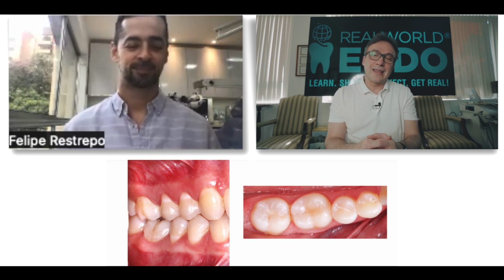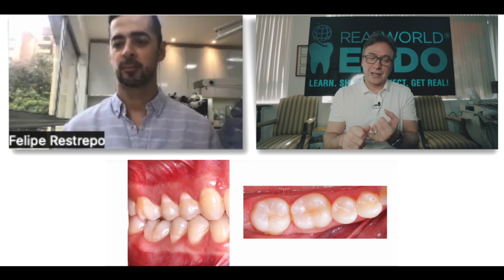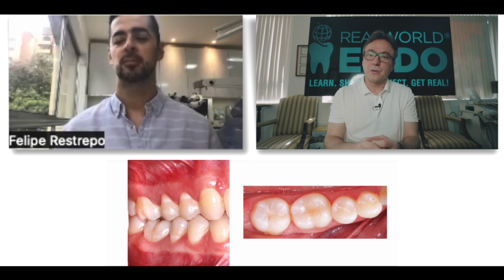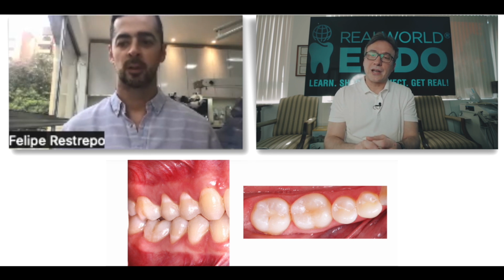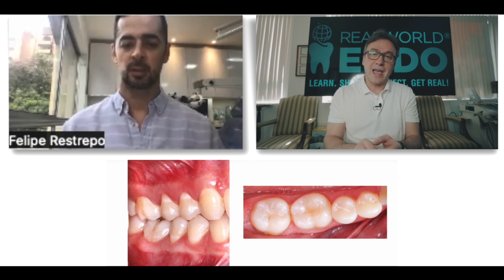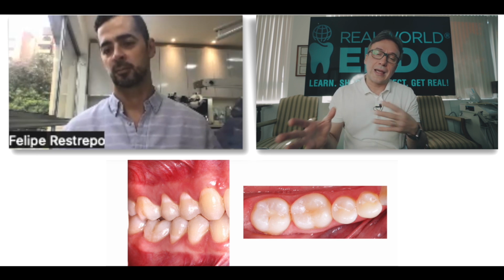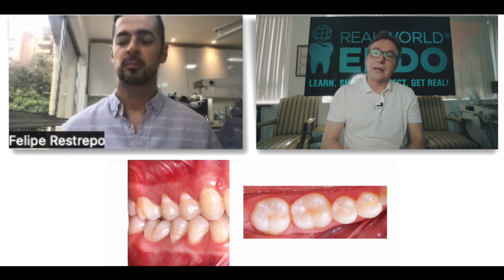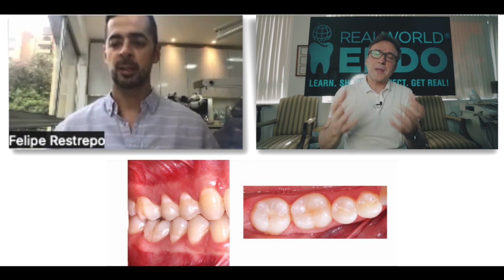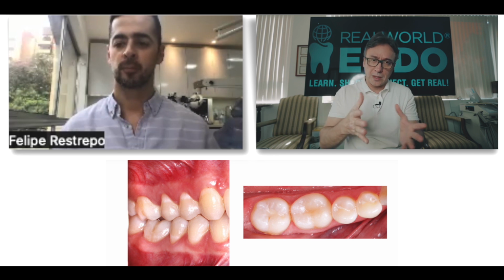Yeah. But the key there is that with dynamic navigation, it helps reduce the amount of fidgeting you're going to have to do in order to match it, which is good for reduced trauma to the surgical site, as well as the fact that you get a closer approximation and you don't end up having to accidentally perforate the buccal or the lingual cortical plate, which can potentially happen.